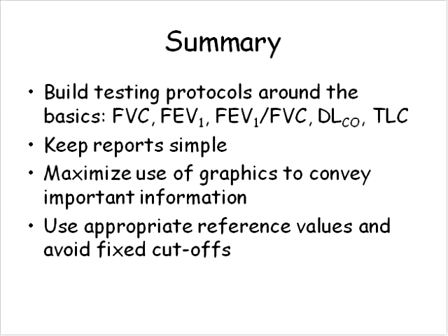But again, I think the key thing here is that you have to evaluate the patient, you have to consider the clinical question that's being asked, why is this test being requested, and then try to use the most appropriate means of connecting to the patient's airway.